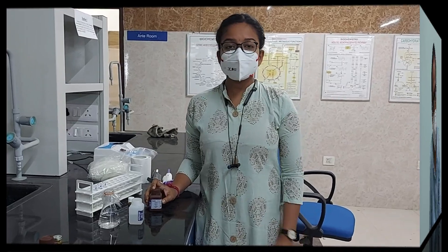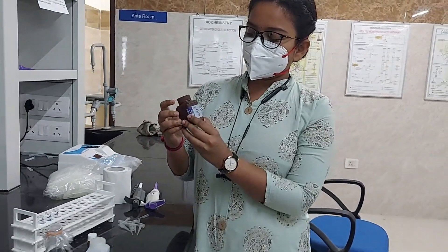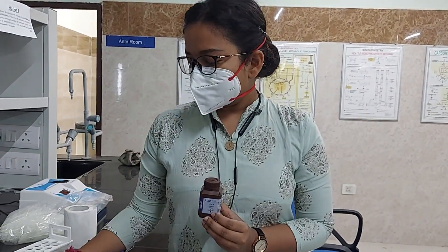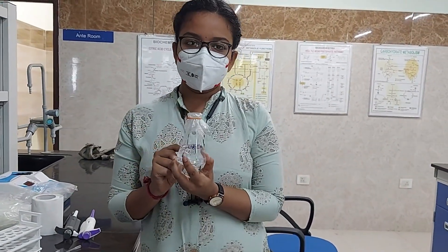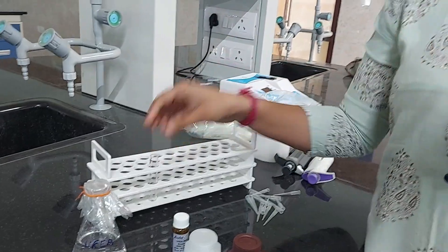Besides the colorimeter, we also need one incubator for incubation purpose, and a micro pipette with tips. These are the main instruments required for this test. This is the provided standard and test sample which will get estimated, and our team has already marked blank, standard, and test for this test.